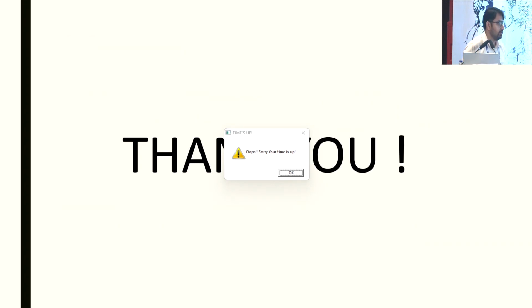So what you have done is generate another AI convolutional neural network model for the grading of images of diabetic retinopathy. What is the advantage over so many which are already available? The advantage, ma'am, is that this is a simple model constructed using just two convolutional layers and two hidden layers. The other models we get are usually built by an engineering department or backed by a department with proper engineering assistance. We wanted to build a model where we didn't depend on anybody, and build a template. So this can act as a simple template.